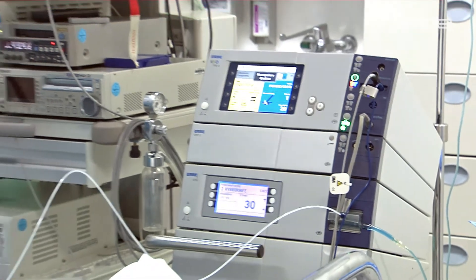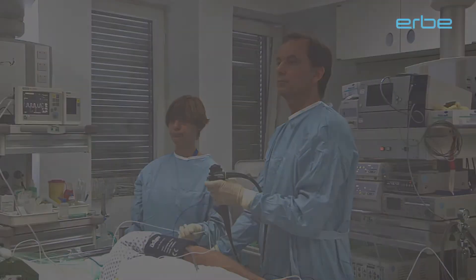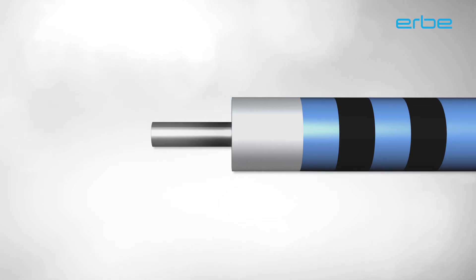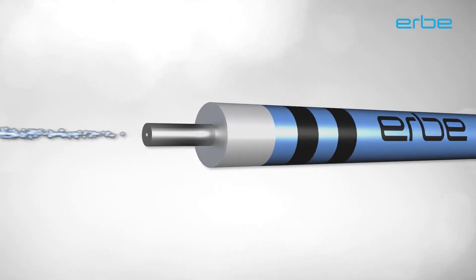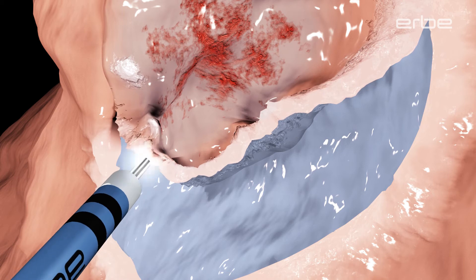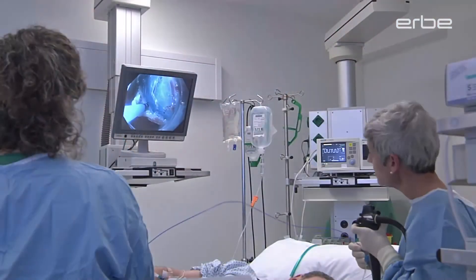The advantages for physicians, nurses, and patients are clear. The hybrid knife consists of an HF electrode at the distal end, whose hollow shaft is also used as a waterjet nozzle. The innovative union of electrosurgery and waterjet technology in one instrument enables new, previously unattainable features.